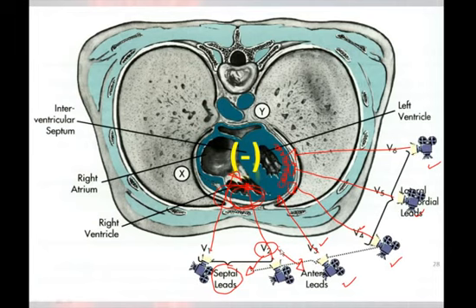It could just be bleed over, as it were, from the anterior leads. The same thing can happen over here in V4. You could have a lateral wall MI affecting V5 and V6, but you have a little bit of V4 because not only is V4 primarily looking at the anterior leads, it is secondarily looking at the lateral leads as well.